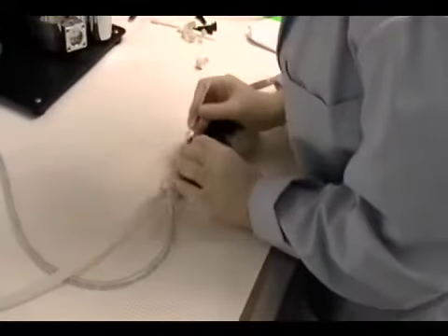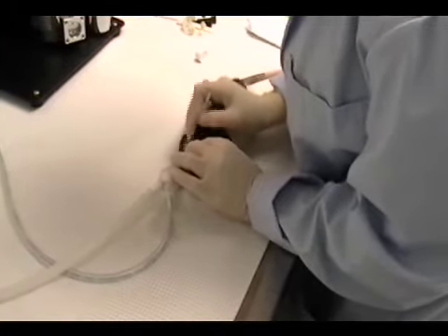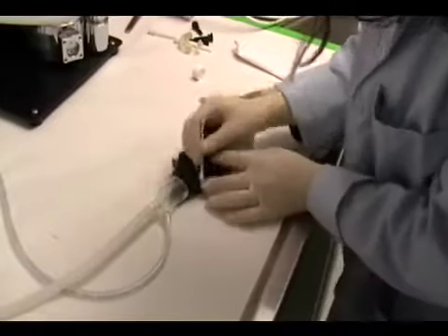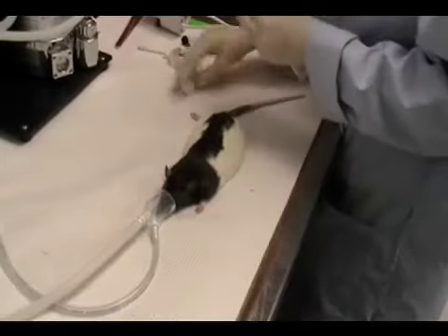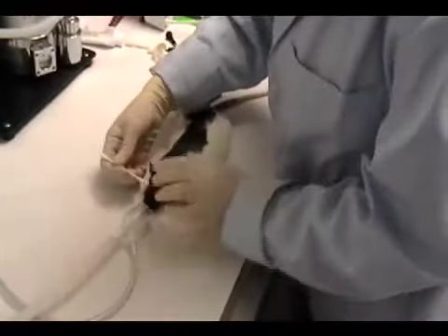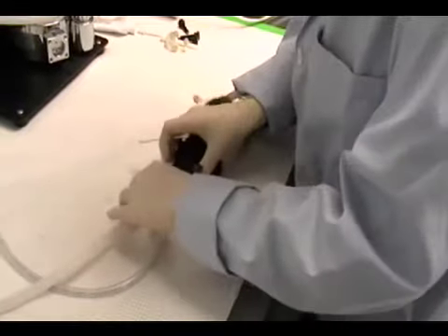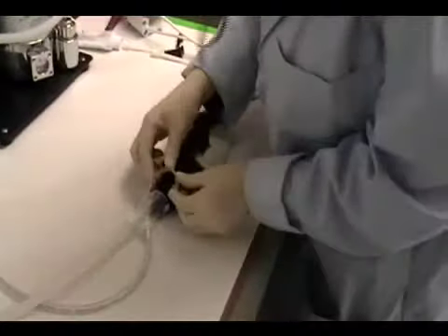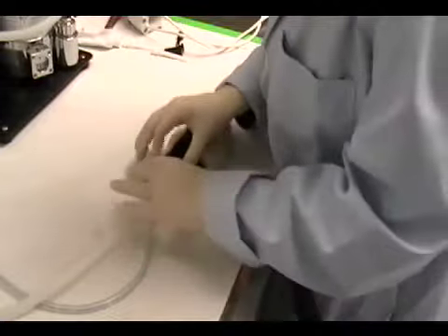We'll now show you research preparing a rat to be placed into the quad coil and imaged. The rat is anesthetized under light isoflurane, and lidocaine is placed under points of contact with the quad coil, specifically in front of the ears and over the nose. A head bar is then placed over the animal's head that sits into two grooves in front of the ears.